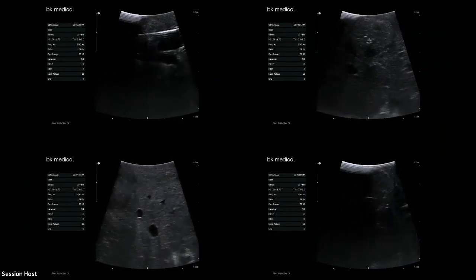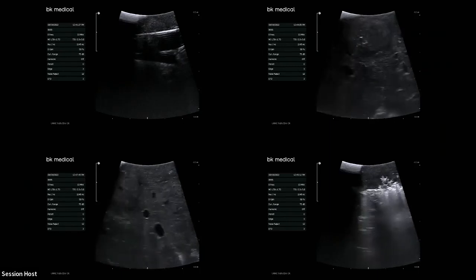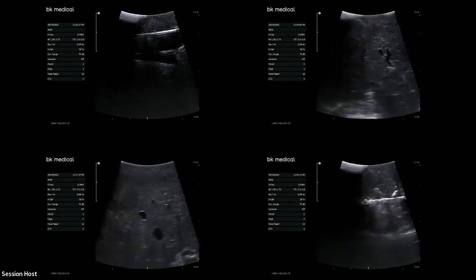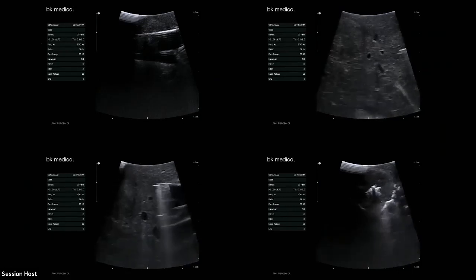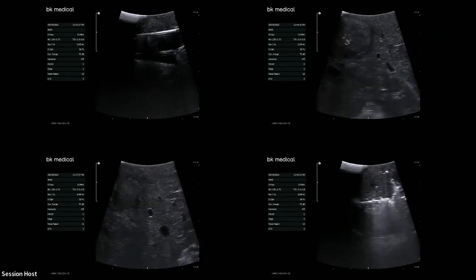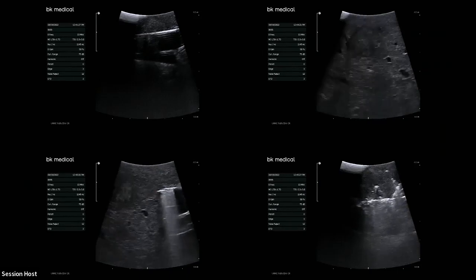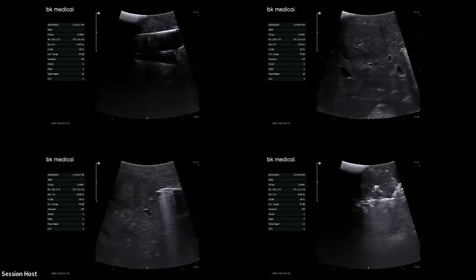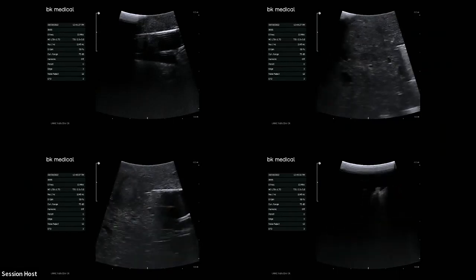But anyway, the nice thing about ultrasound, like I said, is that when you have an ultrasound sitting on a liver, you can see not only all the critical anatomy, but anything you want to target. I don't know if I want to talk too much about technique because there's a course coming up on this, but what you notice on this particular panel is that if you're burning a larger lesion or something of irregular shape, you can use more than one probe.